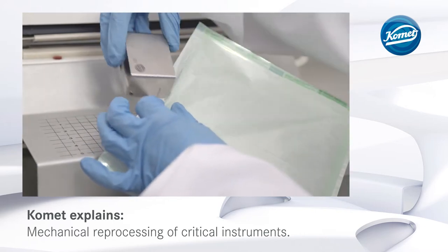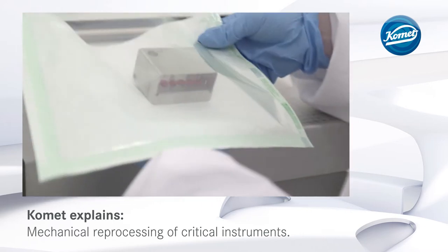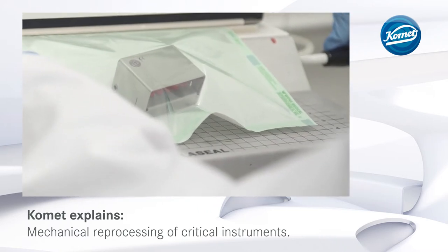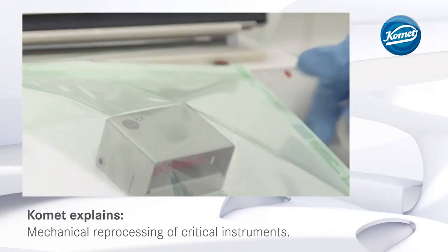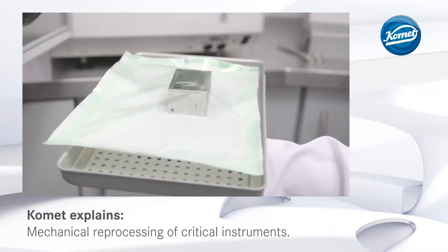After the mechanical reprocessing and the visual inspection, critical instruments have to go through an additional sterilization cycle. To this end, the instruments are sealed in sterilization film. Make sure to adhere to the instructions provided by the manufacturer of the sterilization film, especially regarding the weld seams.